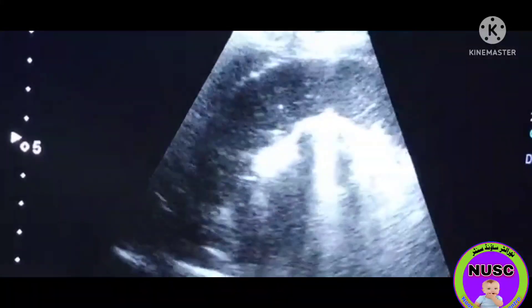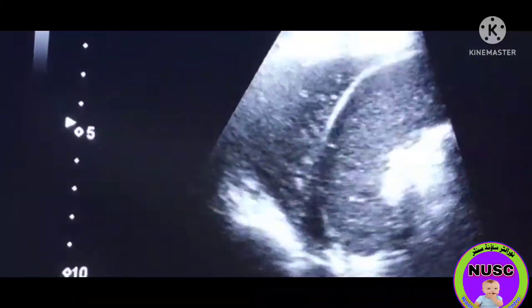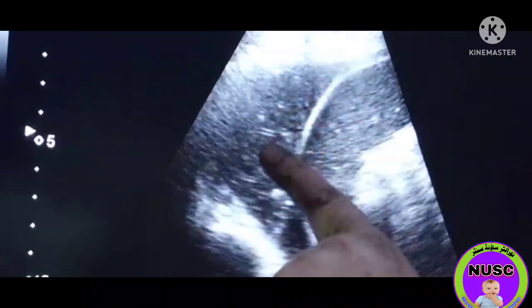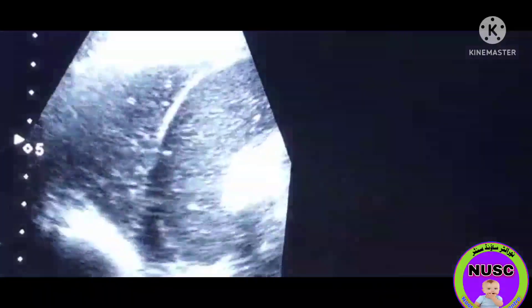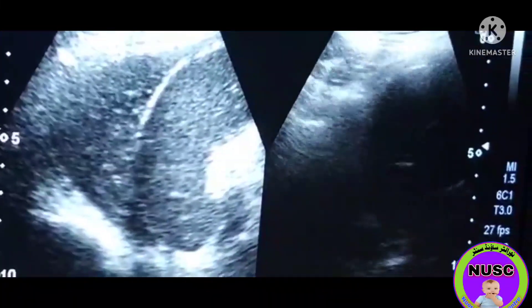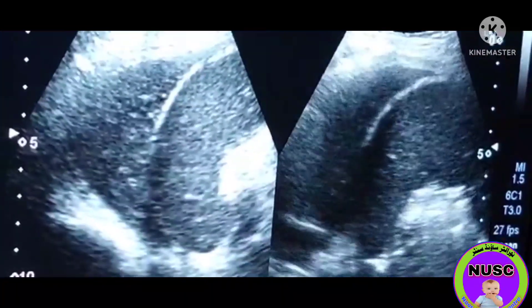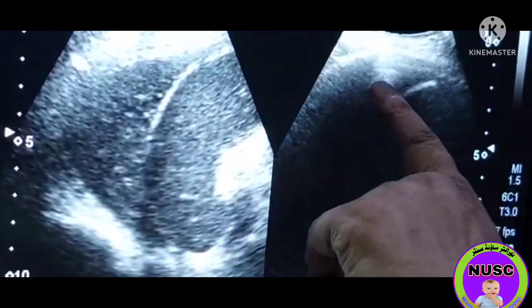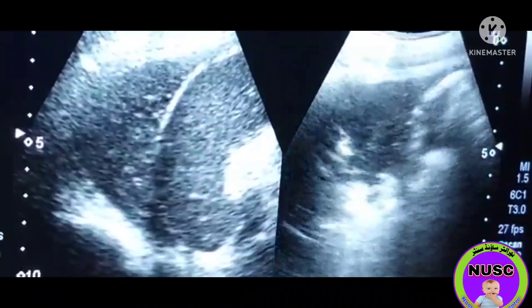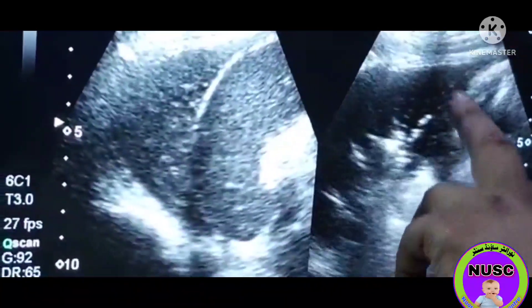So the thing which I want to share — this is the thick fluid. This is not consolidation. This is the thick fluid in the pleural space.